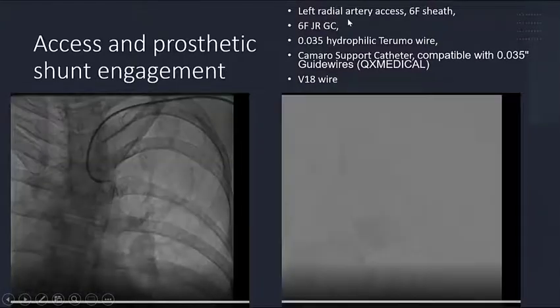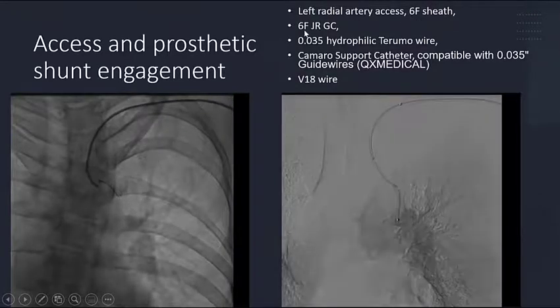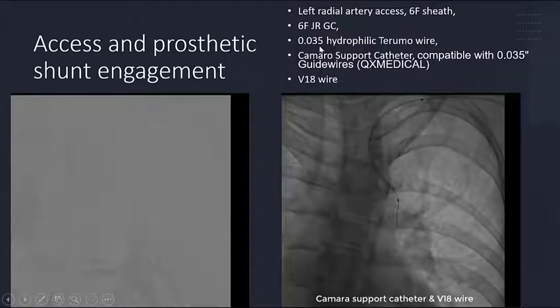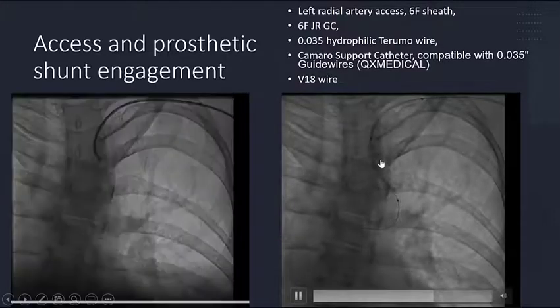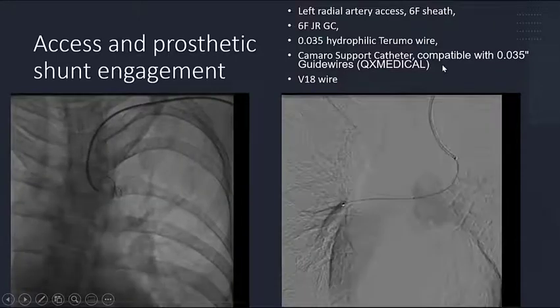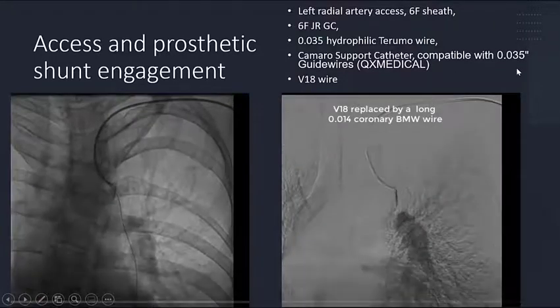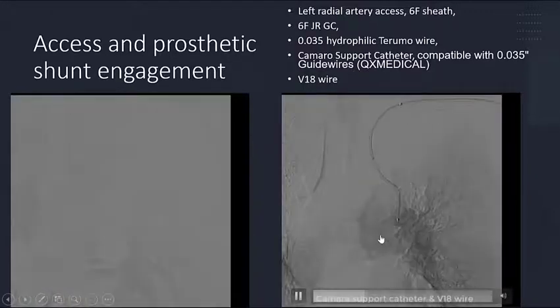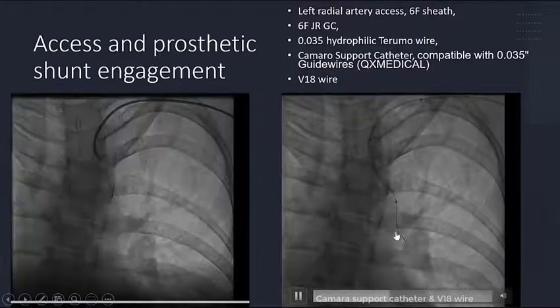Left radial artery access was selected. We used a 6 French sheath and 6 French Judkins right guiding catheter. We also used a 0.035 hydrophilic terumo wire to pass the BT shunt. A coaxial support catheter, as you can see here, was used. It is compatible with 0.035 guide wires. A V18 wire was used to pass the stenosis, as you can see in this video.